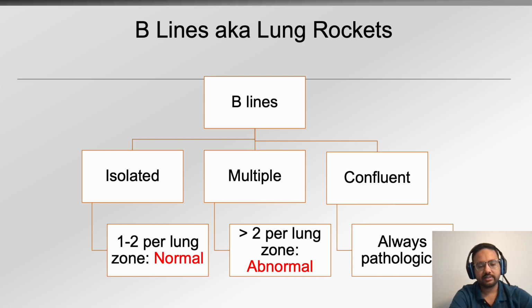For example, let's say a patient has pneumonia of the right upper lobe. We know that this is a focal disease that is only restricted to one part of the lung. And so if I was using ultrasound to look for B lines, where would I see B lines? You're right, you would only see those in the right upper lobe, while the rest of the areas of the lungs would be relatively spared. So that's just one way to think about this.